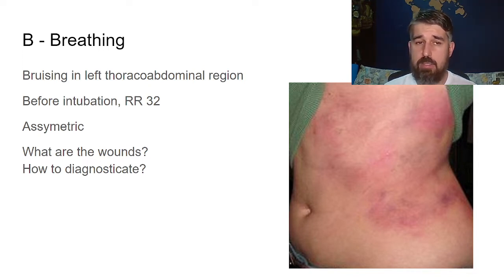Well, usually we would get our stethoscope and try to listen for the lung sounds. If they are asymmetric, you might go for percussion, but we know that this is not the most straightforward thing, especially when you are out of the hospital or in a busy ER with a lot of noise. It may get a little bit difficult to get a very good physical exam. So the solution for this is the ultrasound, obviously.